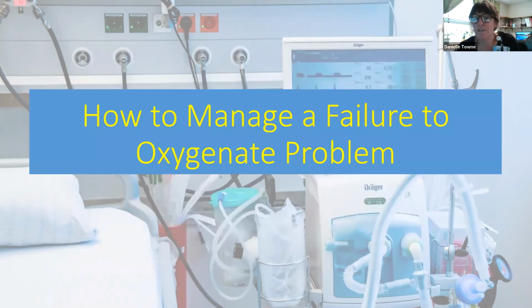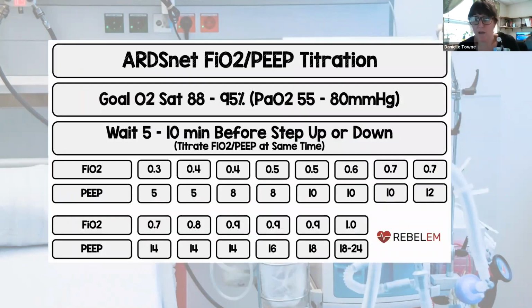All right, how do we manage a failure to oxygenate? There are only two ways to affect our oxygenation, our FiO2 and our PEEP. It works out pretty simply: if you want to affect ventilation, it's tidal volume or respiratory rate. If you want to affect oxygenation, it's FiO2 or PEEP. It's a pretty simple way of looking at it. Increasing the FiO2 increases the amount of available oxygen molecules for the body to use. Increasing the PEEP helps the alveoli open, which increases the surface area between the alveoli and the capillary membranes for oxygen to be able to transport across.